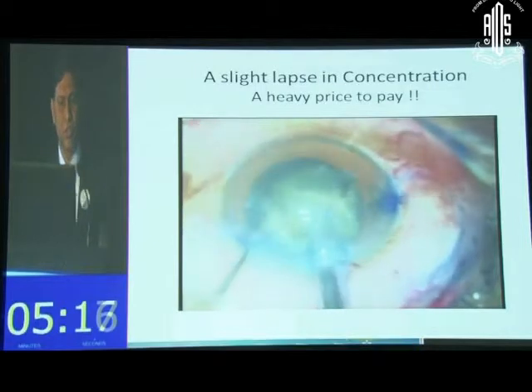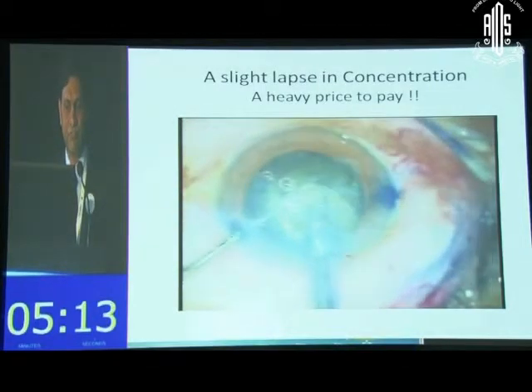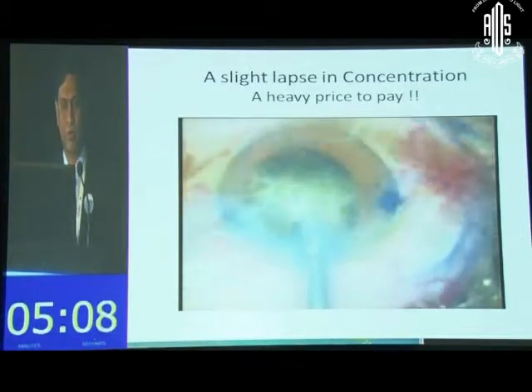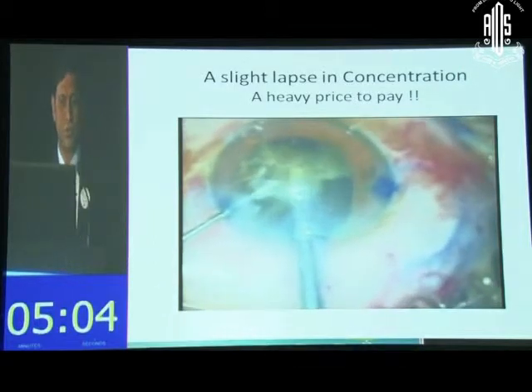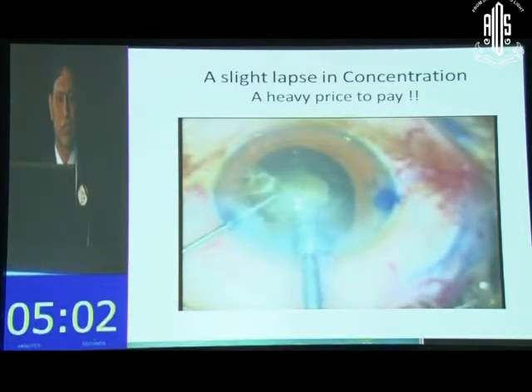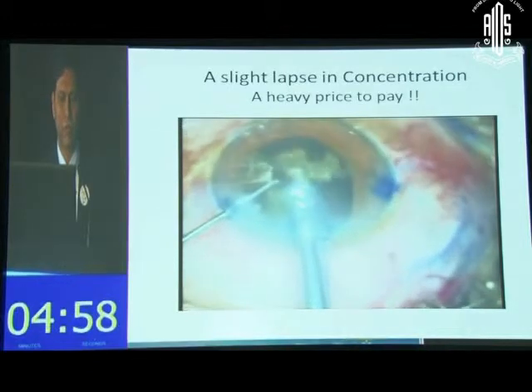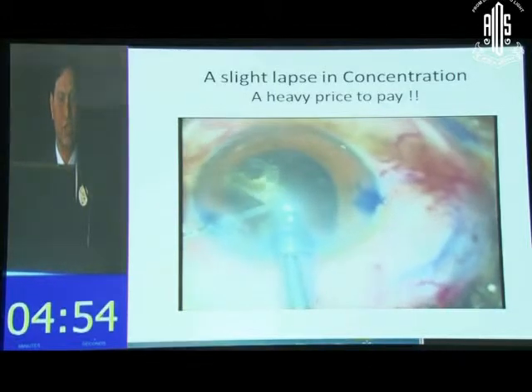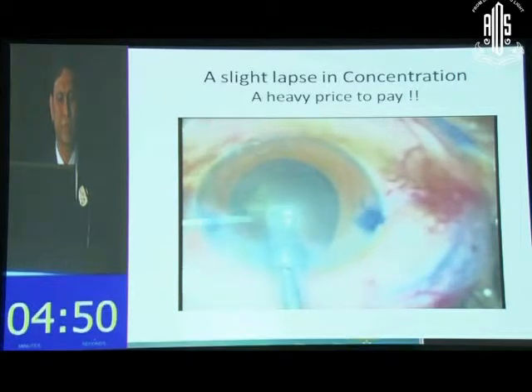I was so conscious this is a hard leathery cataract. I had to break that posterior plate. I knew with every movement that I would probably have a wraparound tear which would go around the equator and go to the posterior capsule. I did manage to salvage this situation by doing that cataract all right. I dealt with the nucleus all right probably, but I had caused a huge burn, and I realized very soon that I had caused this burn, so I knew that the moment I take out the probe, you see what happens.